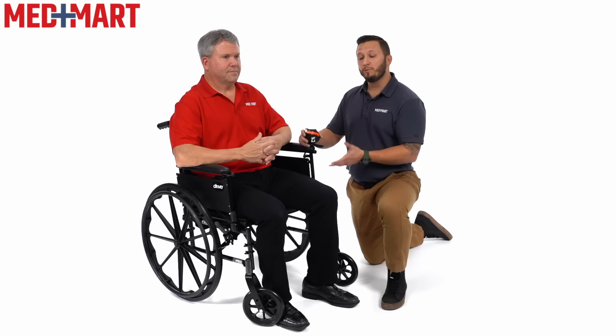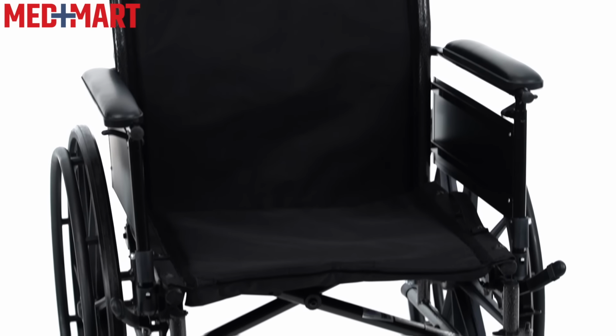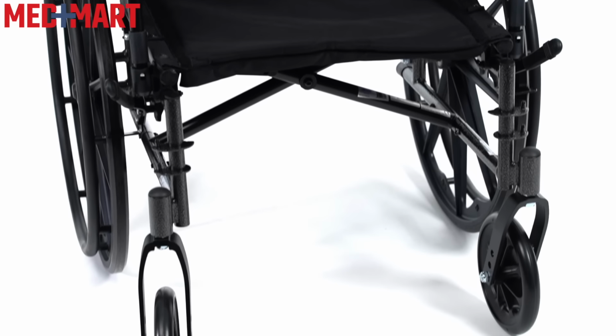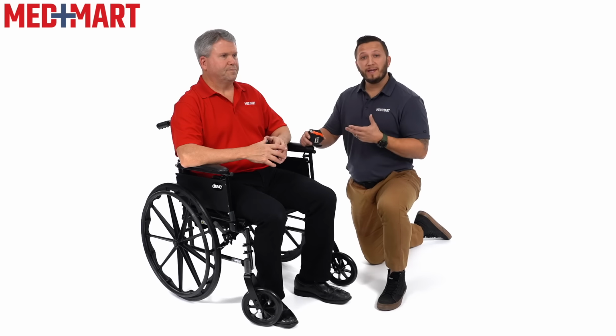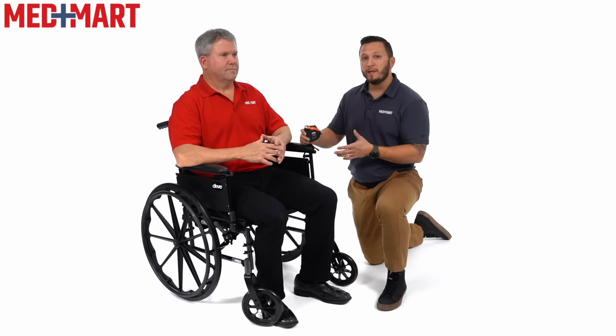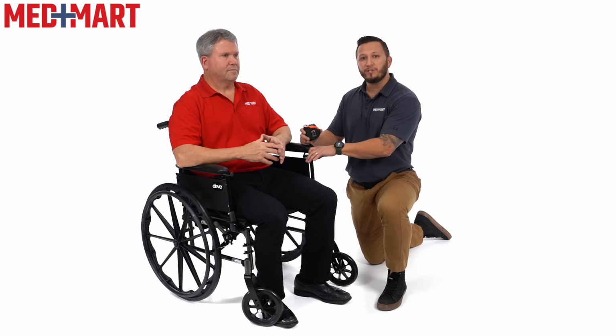The standard manual wheelchair, such as this one, is designed to fit almost everybody. If you're not going to be spending 10 to 12 hours a day in a chair, just need it to get around a little bit, this is probably going to be more appropriate for you. Everybody has a different size and shape, and not every chair is going to fit everybody perfectly. If you're off an inch or so with some of these measurements in a manual standard wheelchair, that's okay.